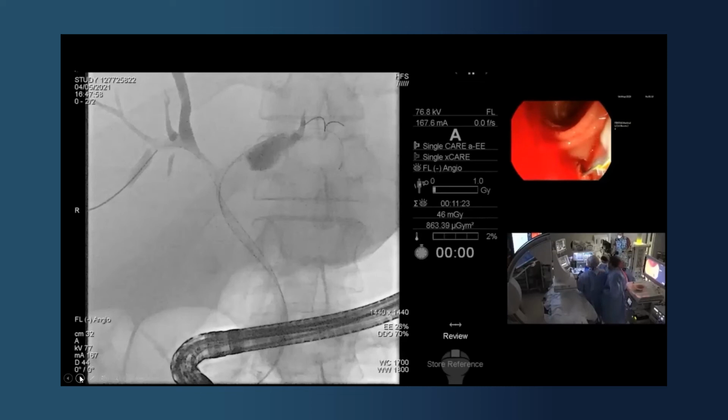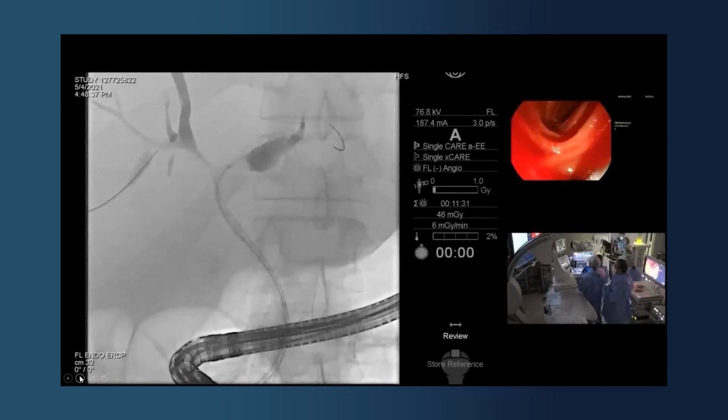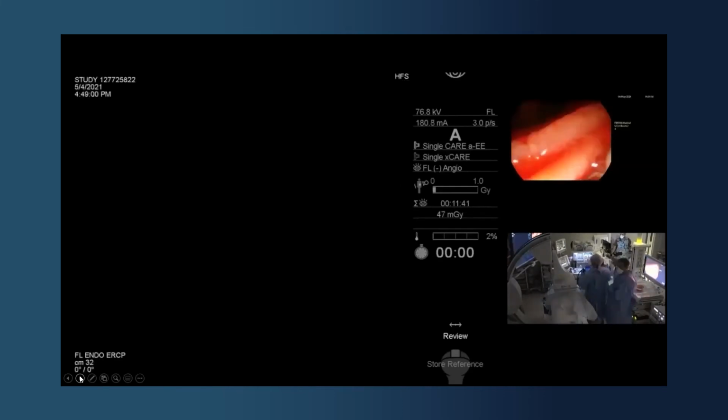Yeah, no, actually, you probably do want to come back, because if your wire is in too far, you then get backward pressure, and it can really affect your ability to advance instruments. Might be difficult getting around this corner. That's nice, that's nice. Little bit further. Screen.